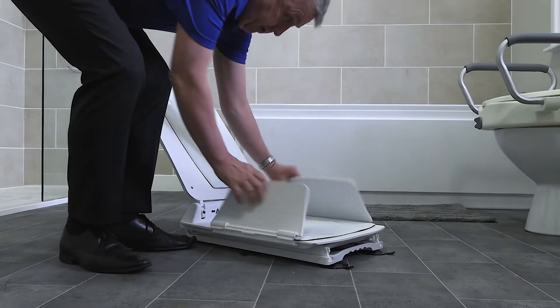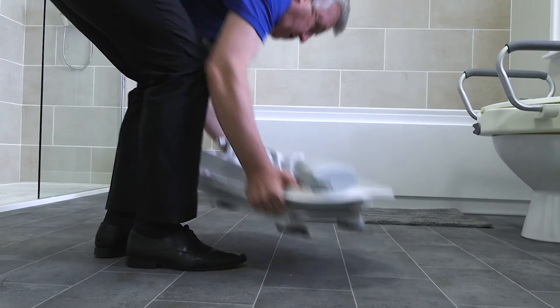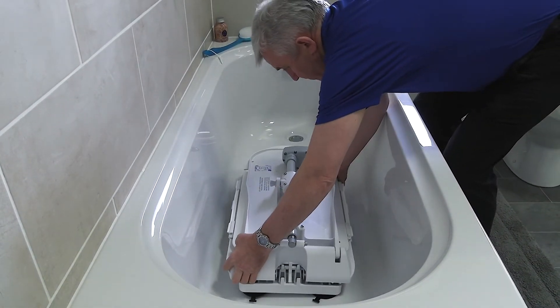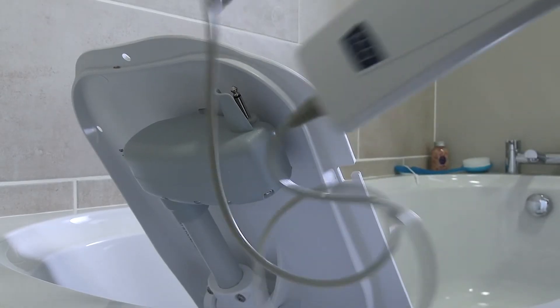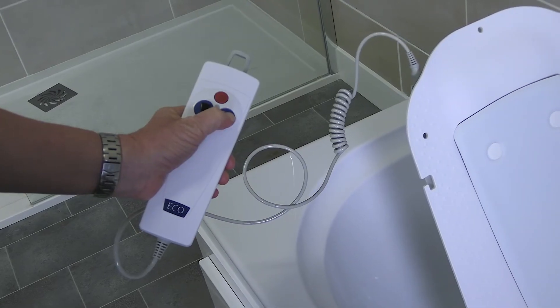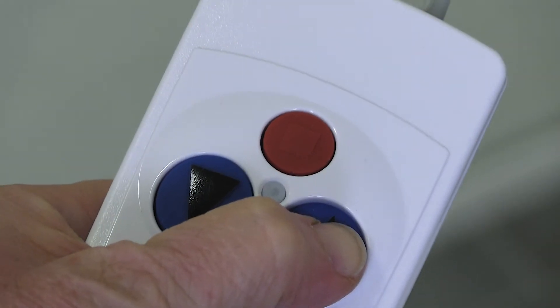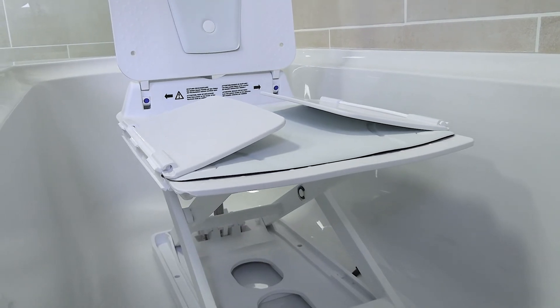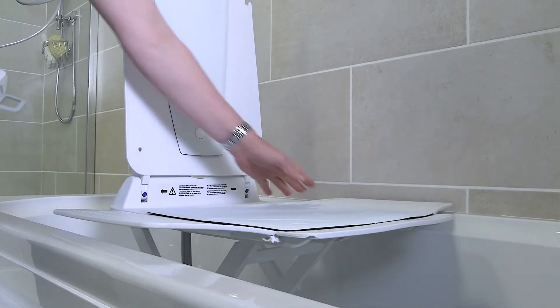Close the side flaps and backrest fully to pick up and move your Assure Bath Lift. When placing the Assure in the bathtub, make sure to leave space so that the backrest can open fully. This will make it easier to attach and use the handset. Use the big buttons to control the backrest and move the seat up and down. When raised, you will want the seat level to the top of the tub so that the user may comfortably slide on and off the seat using the side flaps.